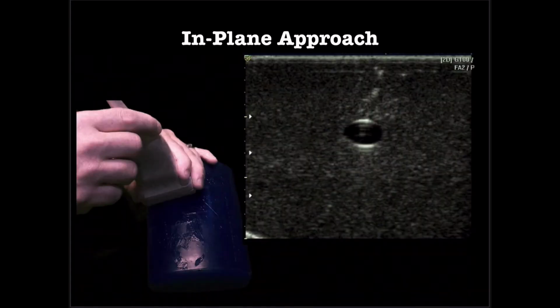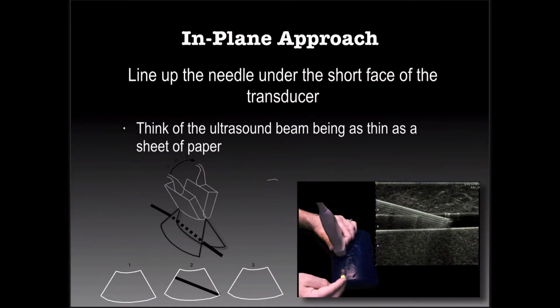Remember, we always start off in cross-section and we do the compression technique. You have to keep the vein on the screen the whole time to know that when you've turned long axis, you're still looking at the same vein. This is the hard thing to do. People slip off the vein and then they're not looking at it for a few seconds. And then they go parallel to the artery and they think they're looking at the vein. Remember, you can't do the compression technique in long axis because you don't know if you're compressing the vein and the vein is disappearing, or you're sliding off the vein onto the artery and the vein is disappearing because you just are slipping off of it. So this is where people make mistakes with this.